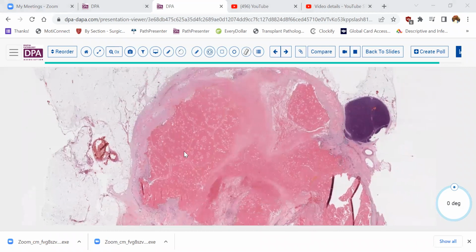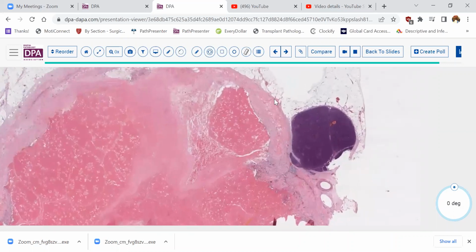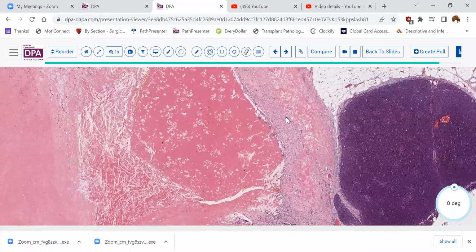had a course of additional chemotherapy. Following the chemotherapy, there was still some residual tumor, and surgery was performed. And so we don't often see chemotherapy effect with granulosa cell tumor in the recurrent situation. And so I thought it would be interesting just to highlight this in this circumstance.